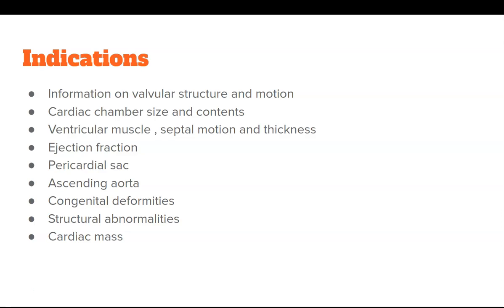So a blood clot inside a cardiac chamber is very dangerous. If you want to assess any thrombus formation inside the cardiac chamber, echocardiography is the best, because cardiac chambers move because of systolic contraction and relaxation.